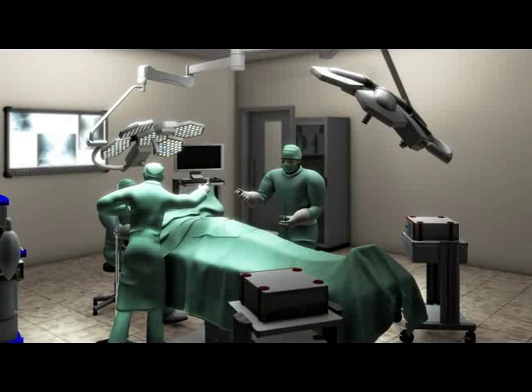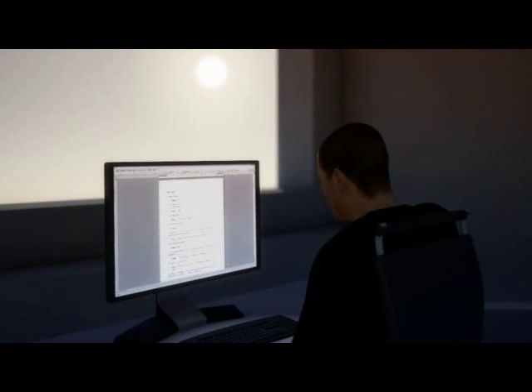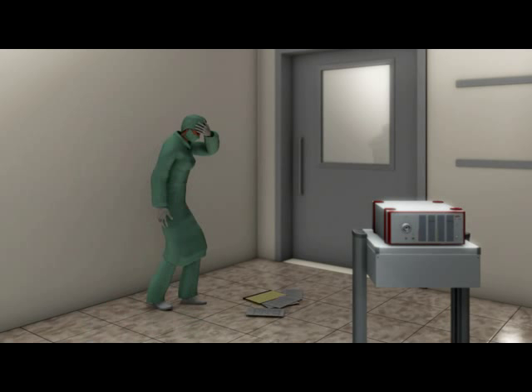The operation is also finished in the standard operating theatre. The surgeon will do the operation report later. Manually prepared documents and any earlier findings and X-rays are packed away into a folder.